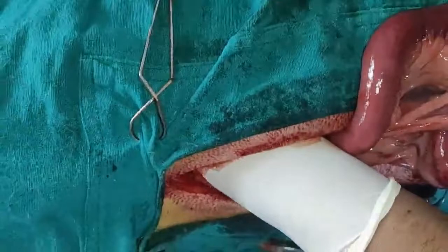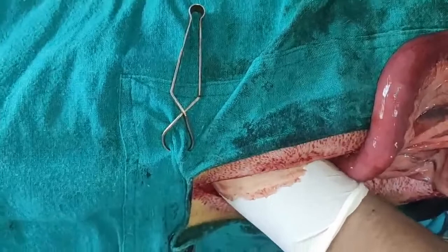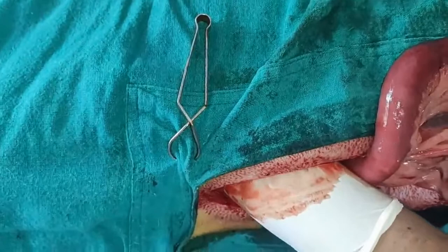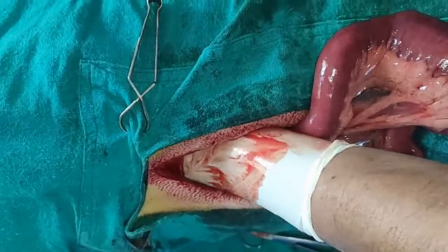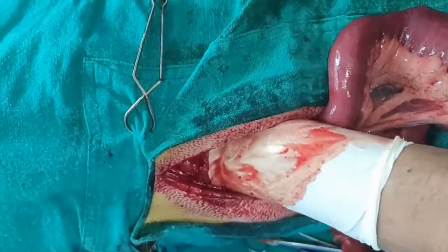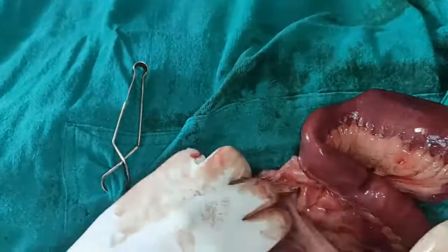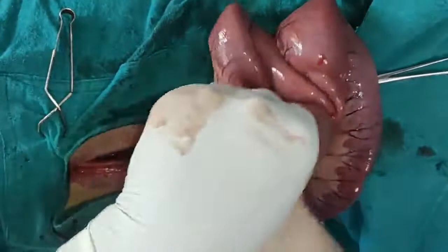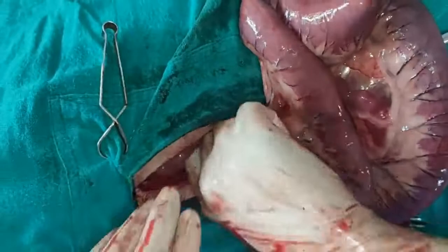Although by radiograph and contrast radiography, that is the barium series, we couldn't find anything in the stomach. So the stomach is okay, no problem. Liver is okay. Lastly we should examine this one, the duodenum also. So we should examine it properly. We just examine the duodenum. Okay, it's fine.